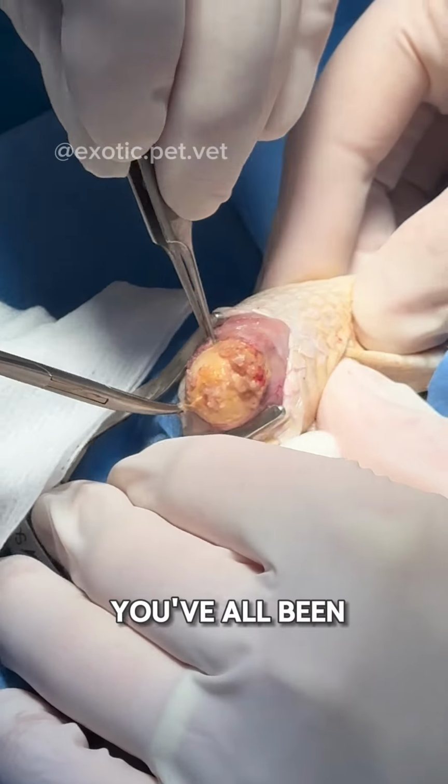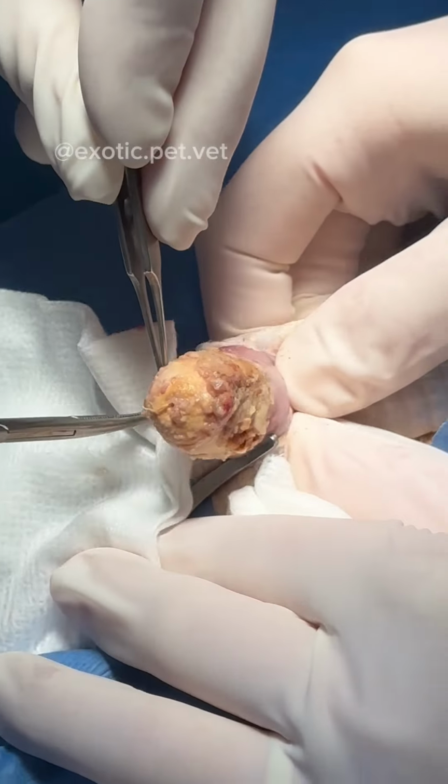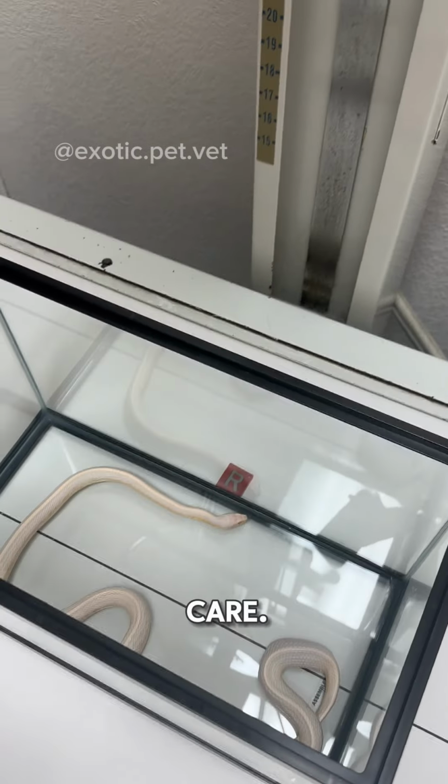Here's the video you've all been waiting for, the removal of the corn snake's retained egg. So how did we get here? Well, this corn snake had been egg-bound for quite some time, about 6 months. I took her in and immediately started getting her care.